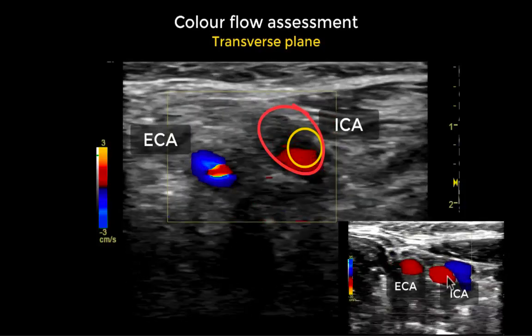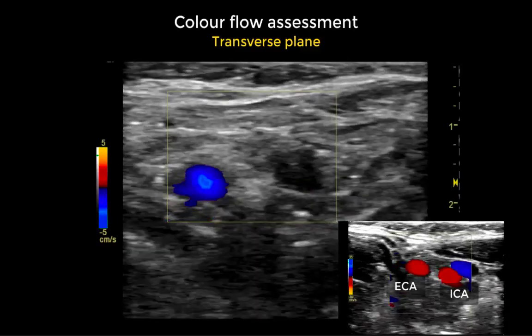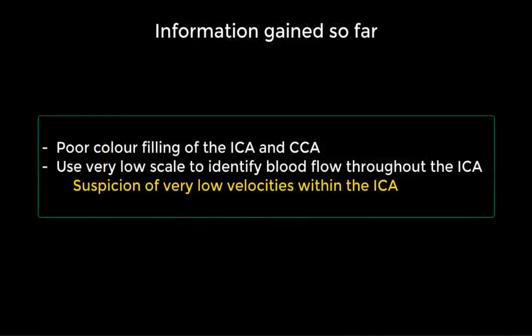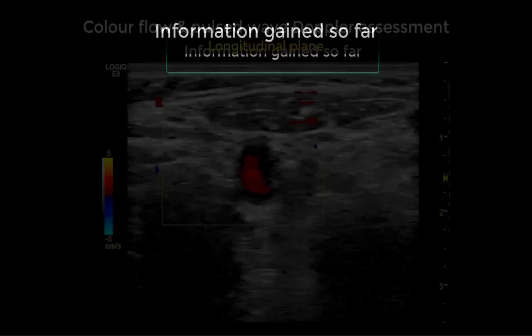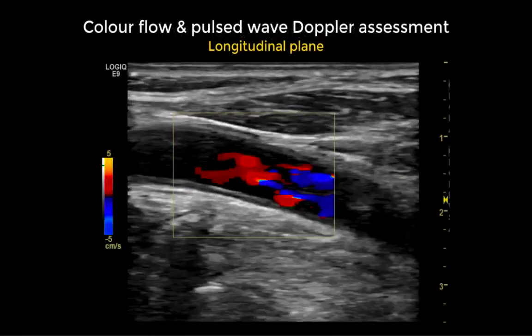At the bottom right corner you can see what a normal internal carotid artery should look like. The findings so far using colour show poor colour filling of both the internal and common carotid artery, which is probably indicative of very low velocity. We used a very low scale to identify these low blood flow velocities.